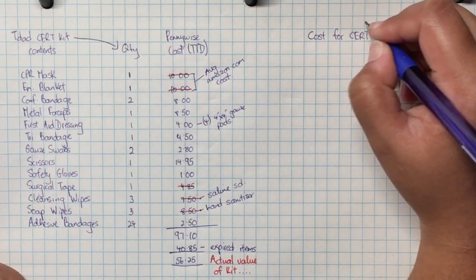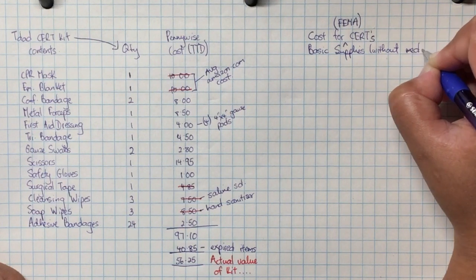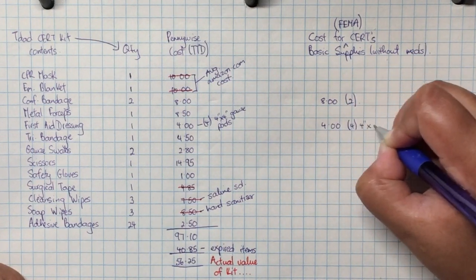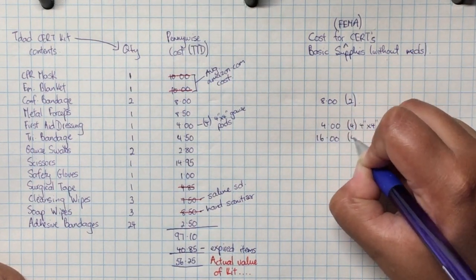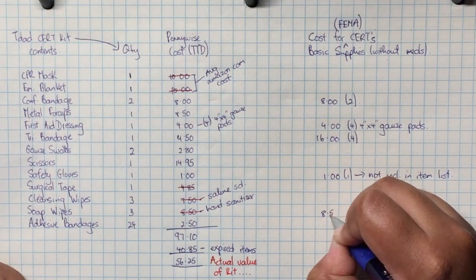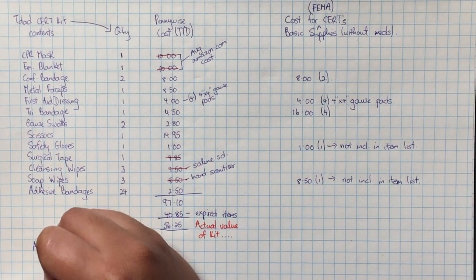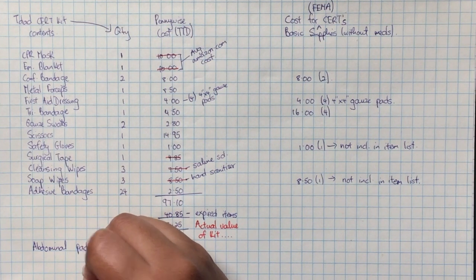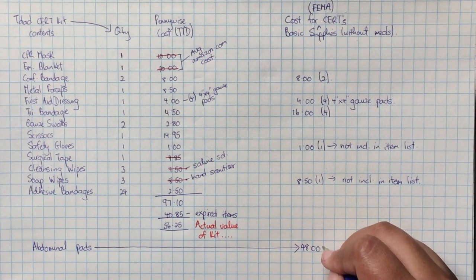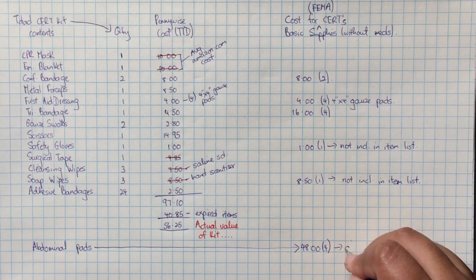Then, based on FEMA's minimum first aid requirements, I also tried to tally the basic CERT items, minus over-the-counter medications and my own medications. I added on a few things; gloves were not included, neither was hand sanitizer, which I think is basic. Abdominal pads were also not included in Trinidad CERT's kit. I did not find any in Pennywise, but they were $48 TT for 4 on Amazon, and I'm sure I could get them locally.